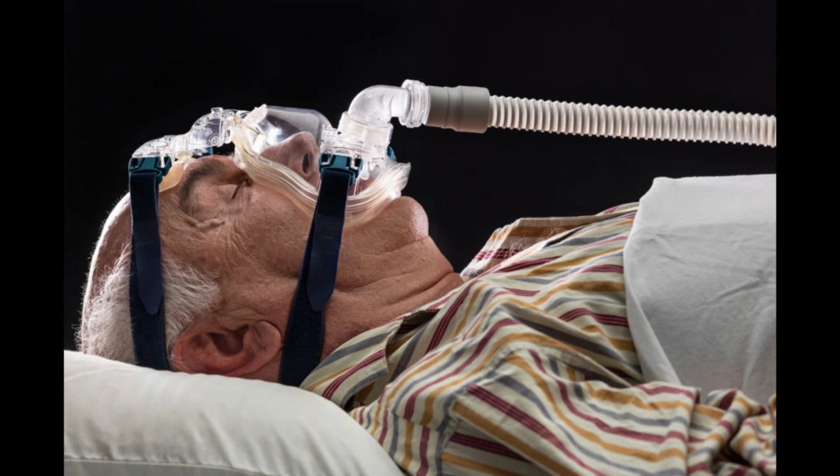Quite frequently, a lot of the leaks that occur late at night I call REM leaks. During REM sleep, all of the facial muscles as well as the skeletal muscles of the body are paralyzed to prevent the body from acting out dreams. And so when this happens, the mask that was perfectly tight is suddenly loose and leaks occur. But then when the patient wakes up from his REM sleep or his dream state, his muscles are restored and the mask stops leaking.